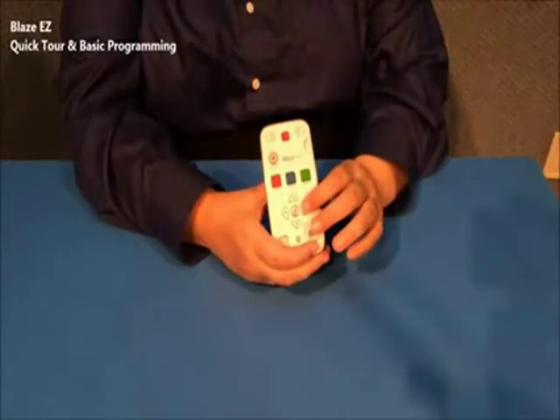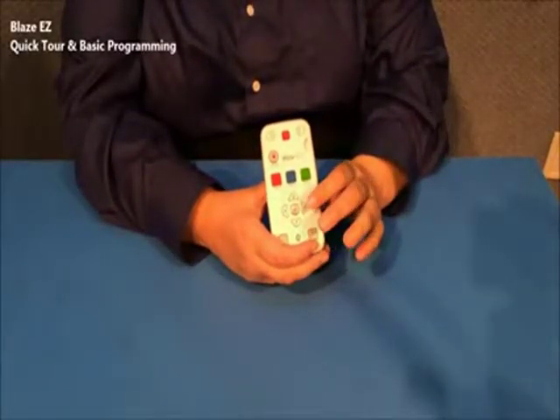Well, that's not a very good song, so I can move through the tracks using the right arrow.